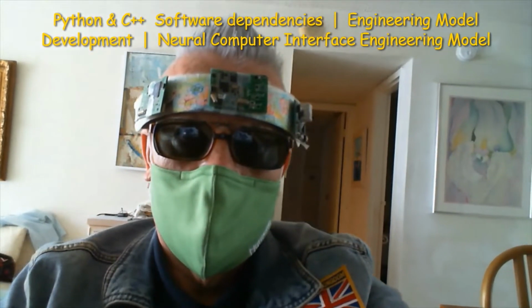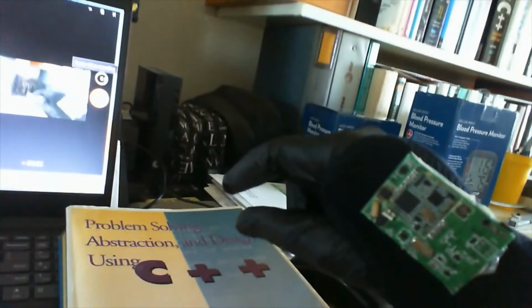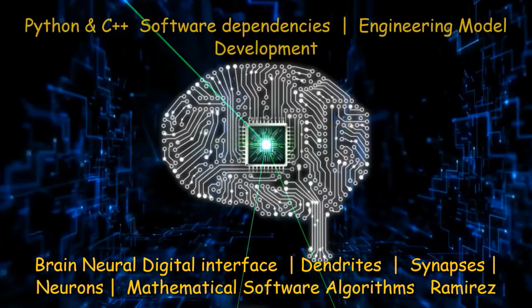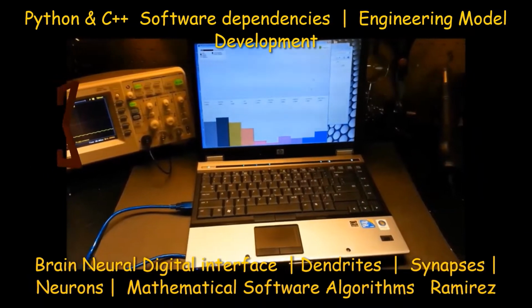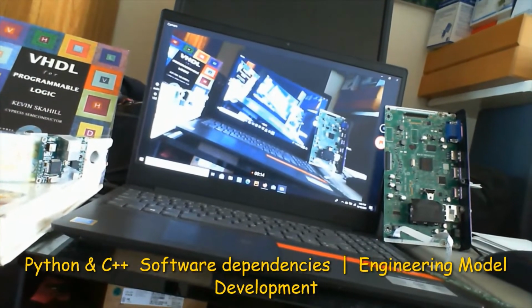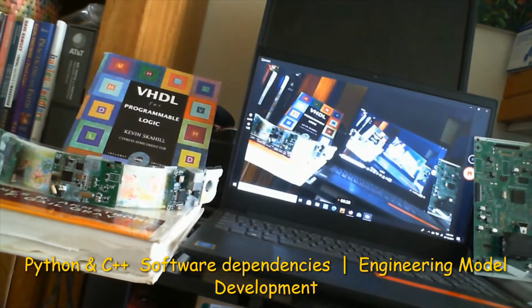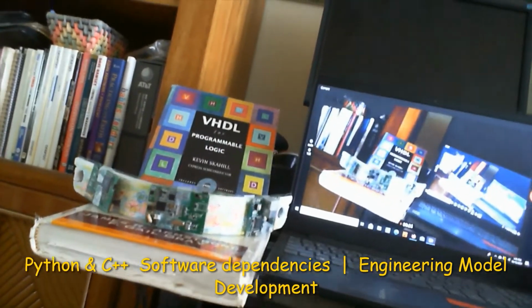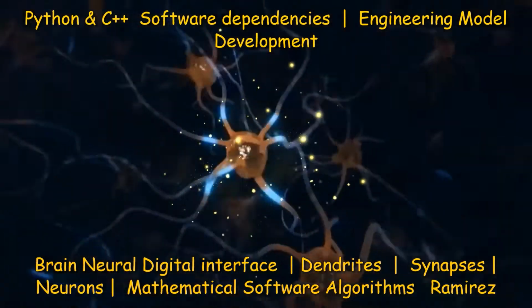The translation is achieved using a pattern recognition approach, that is, using feature extraction and classification. So, feature extraction aims at describing the EEG signal with a few relevant values called features, based on the algorithm.